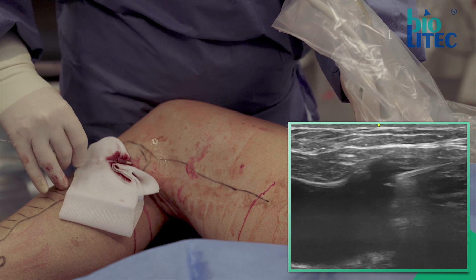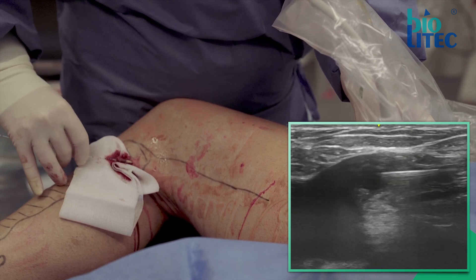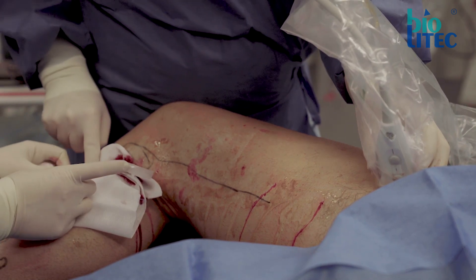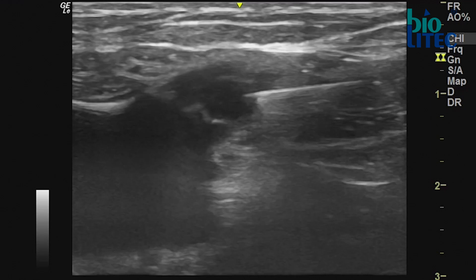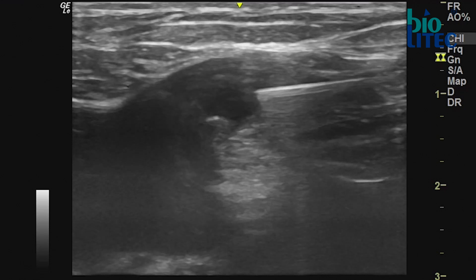Always make sure the catheter is in the right position over the whole length. In rare occasions it can enter the deep venous system via a perforator in the thigh. Finally, the catheter is fixated to prevent any further movement, and from this point on the position of the leg has to remain unaltered.